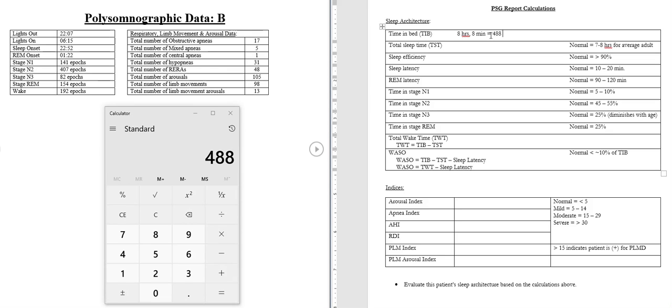But that seems kind of like a little confusing, which I completely understand. Especially if the time, counting forward with the military time or that type of thing, like I said, I just counted on my fingers to do that.